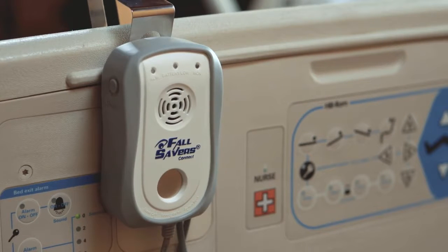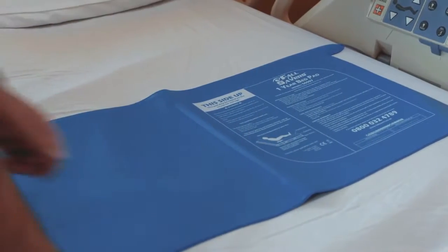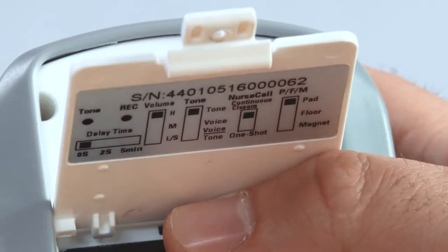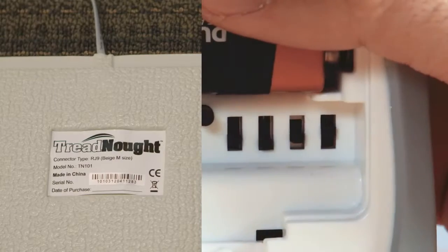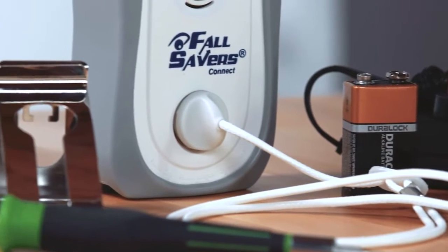To begin, be sure your base unit is set up according to your preferences. If you are using the bed or chair sensor pads, be sure the PFM switch located in the battery compartment is set to the upper pad position. If you are using the floor sensor pad, be sure the PFM switch is set to the middle floor position. If you need assistance doing this, please refer to the base unit setup video.